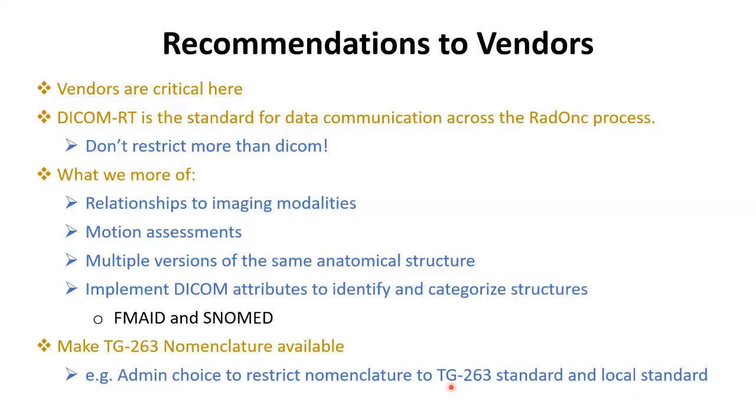But we need to extract data. And I showed them, if you write your own structures, then it will be done, but there is no script for your structure set, so I cannot extract all this information. When you tell them there is no script, it means they have to do it on a manual basis. They have to open the DVH and grab each piece of information for that structure. It will take maybe 30 minutes or 1 hour to extract the data, and then it will not be reported.